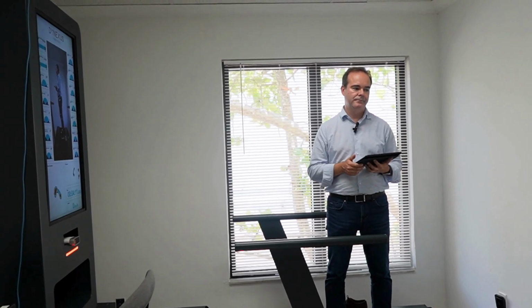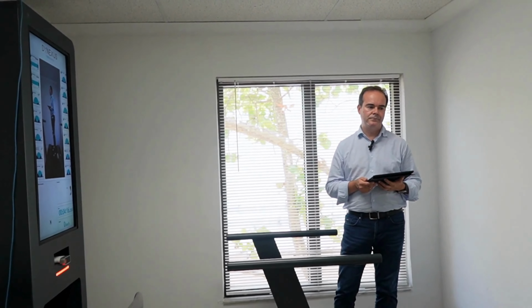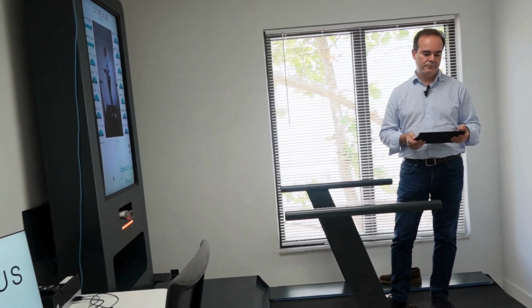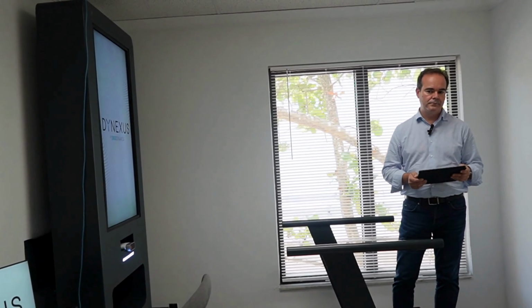We see ever so many patients in our clinic, and the first symptoms and signs of neurodegenerative disorders are not necessarily intellectual cognitive decline, but motor disorders and gait, early slight gait changes, and each neurological disorder almost has its own signature gait abnormality. Could this machine be even more subtle and pick up earlier, do you believe? I don't know if pick up earlier, but identifying earlier stages, yes.